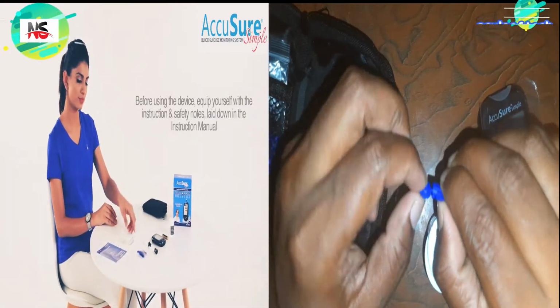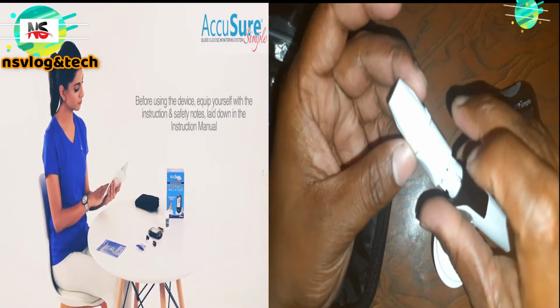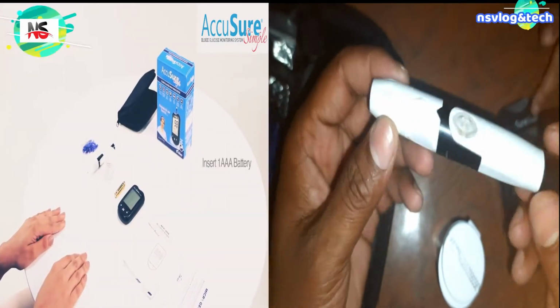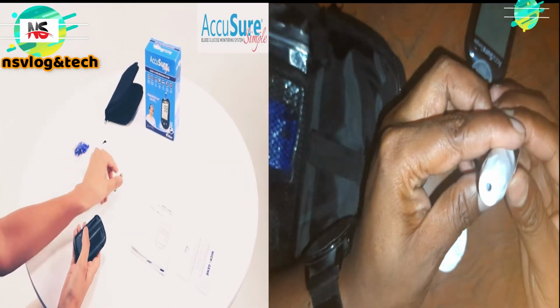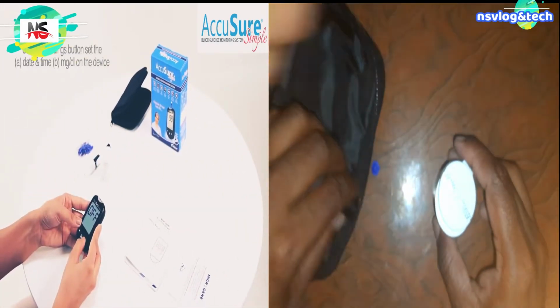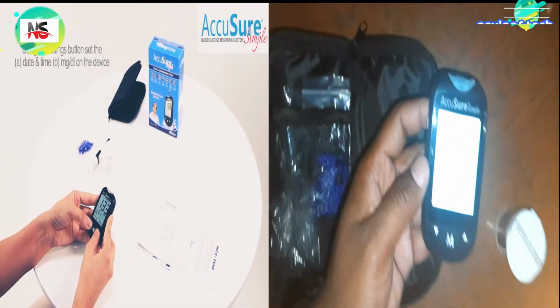Before using the device, equip yourself with the instruction and safety notes laid down in the instruction manual. Insert one AAA battery and shut the compartment. Using the settings button, set date and time and milligrams per deciliter on the device.